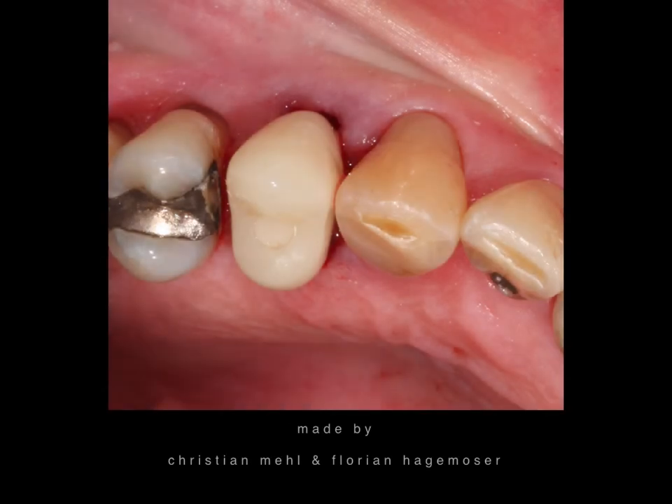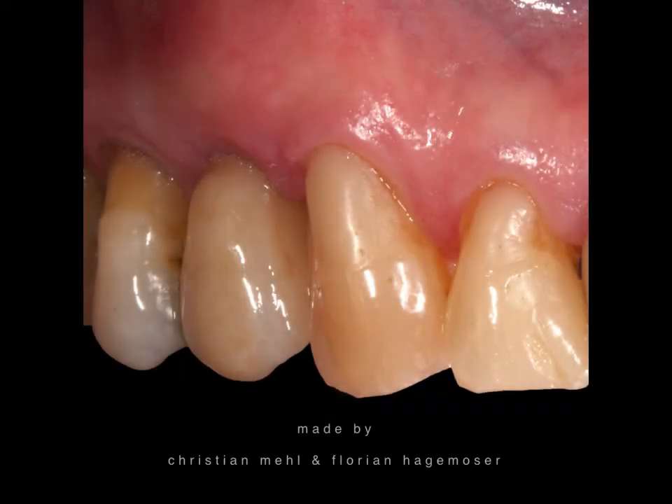The whole procedure was done in less than half an hour — extremely comfortable for the patient, who doesn't have to wait for the laboratory to finish the temporary. Absolutely brilliant. Here is the final crown: the soft tissue anatomy is completely fine. For the patient, extremely simple. Thank you very much for watching, and I wish you all a good start into spring.